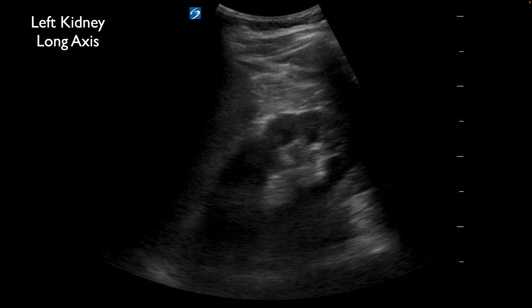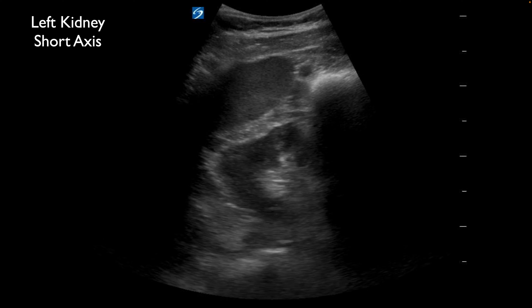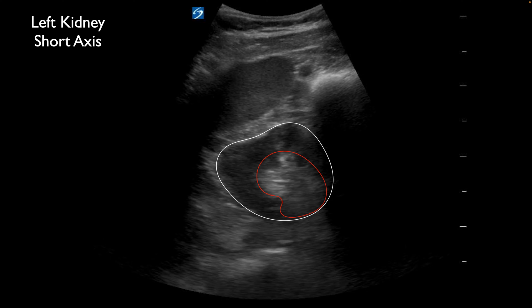We're going to move the probe just a little bit to get a better view of the kidney and subsequently pay attention to the renal pelvis. Ideally we're going to see the renal pelvis extend all the way out to the medial capsule. When we look at the kidney in short axis, we again see the kidney and the renal pelvis comes into contact with the medial portion, which helps us confirm we're in the right plane. Right through here we can see that it is hyperechoic and connecting with that medial capsule.